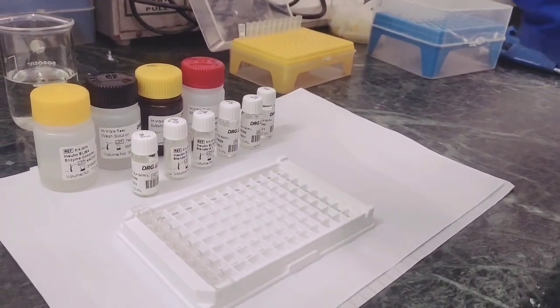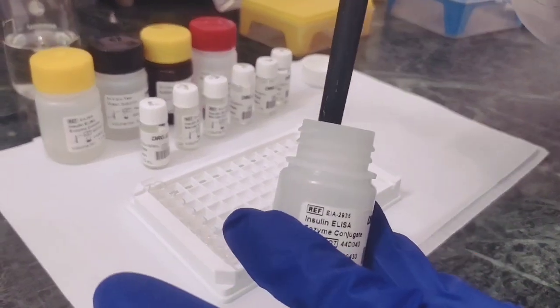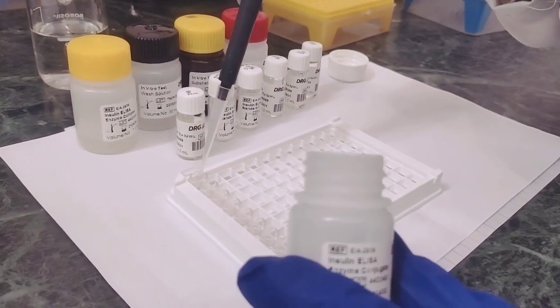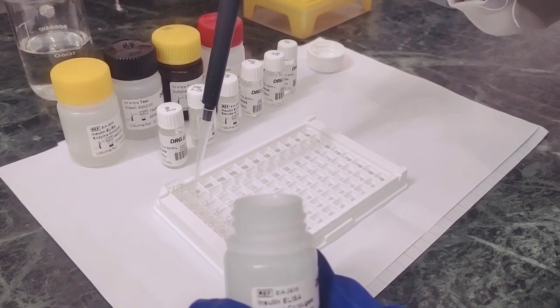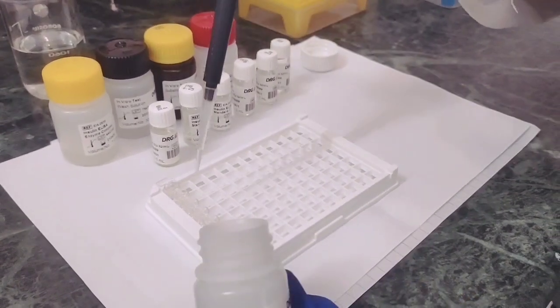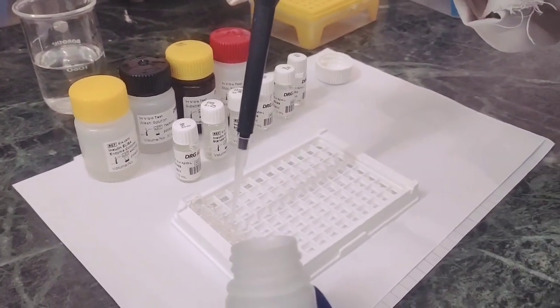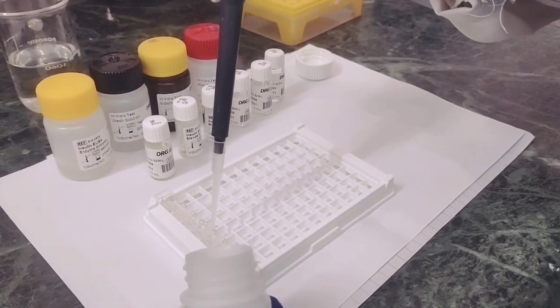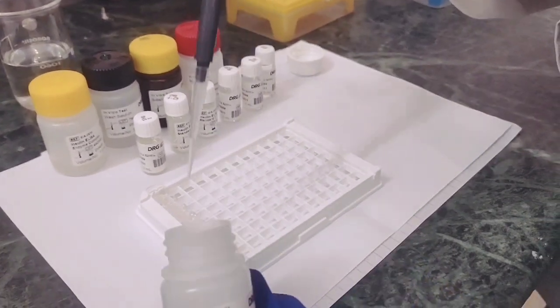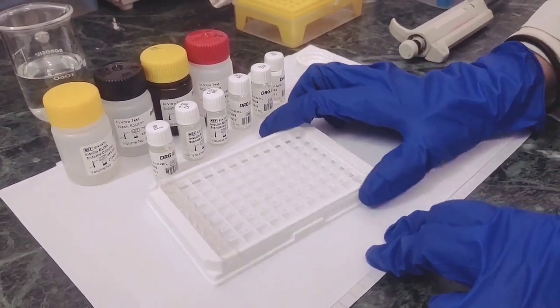Now we will add 25 microliters of enzyme conjugate in each well. And we'll mix and incubate it for 30 minutes.